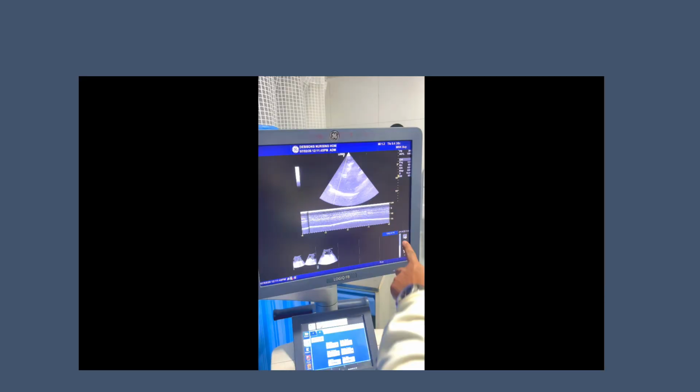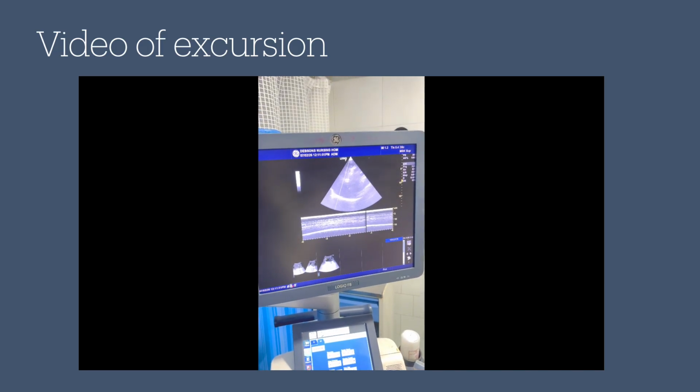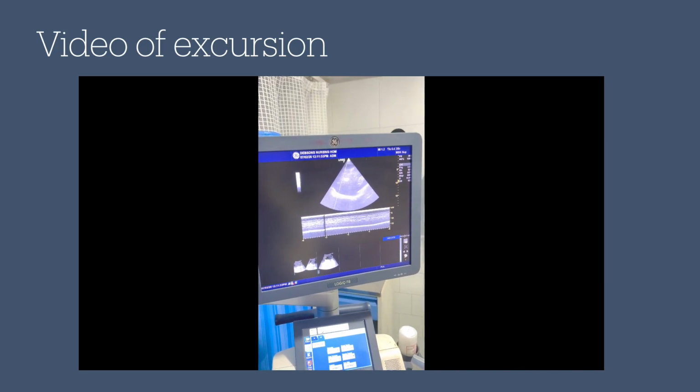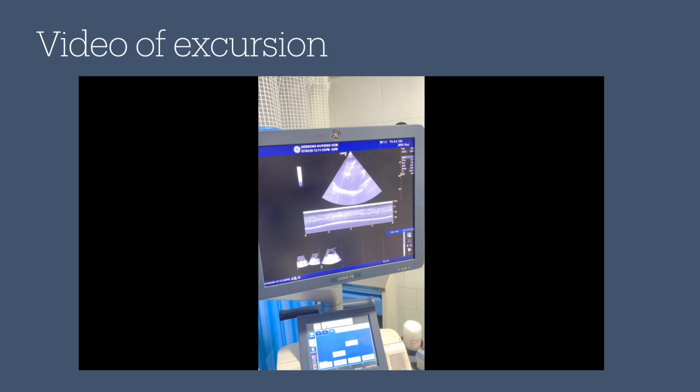Here is a beautiful video describing the excursion technique and the measurement. You can see here. Okay, here M mode is on and you can see the wavy appearance of the diaphragm. We froze the image and took the measurements. Here you will see in the video also beautifully.